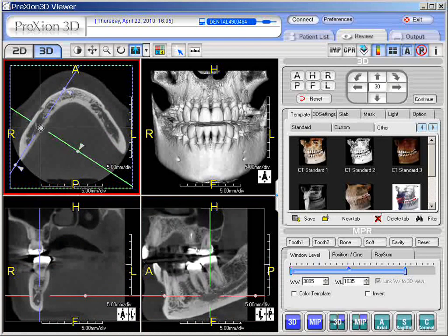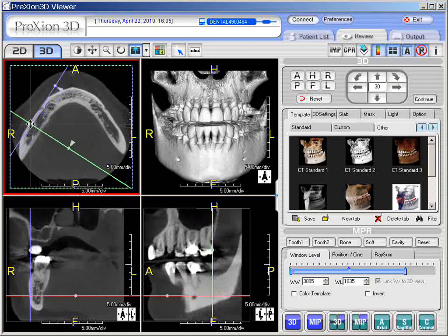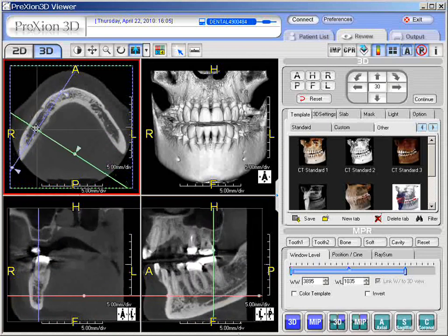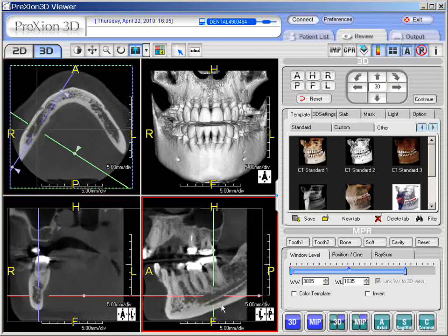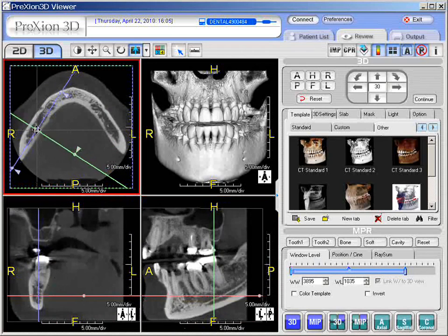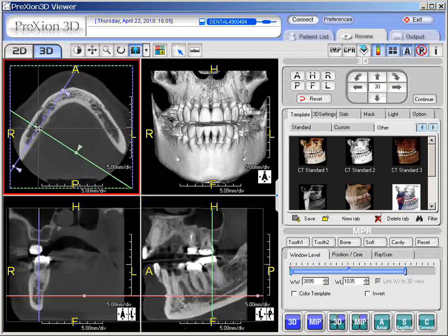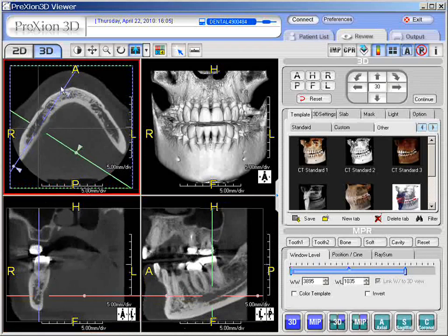Now, if one wishes to move buccal-lingually, you can go back to the center point. Notice the four arrows in the axial screen. Once I left click that, I'm going to drag it either buccal or center and back to the lingual portion. We're looking at this with the sagittal and also the coronal views. That is a beautiful way — you can do this for any part of the dentition and line it in three projections. I particularly like to get the coronal view and put the vertical blue line in line with the side that we're looking at.